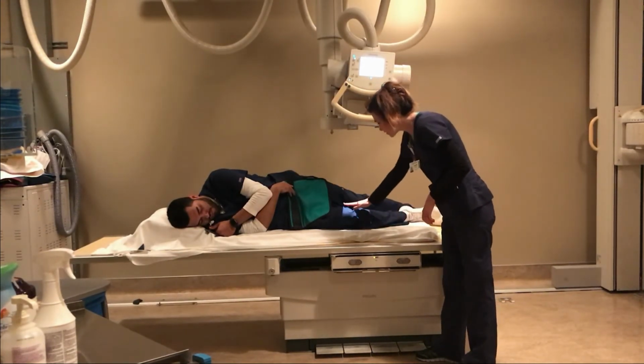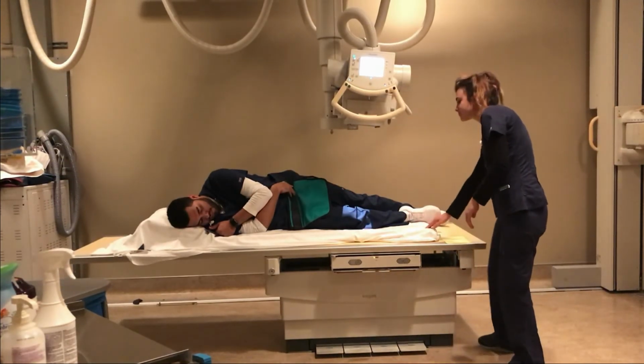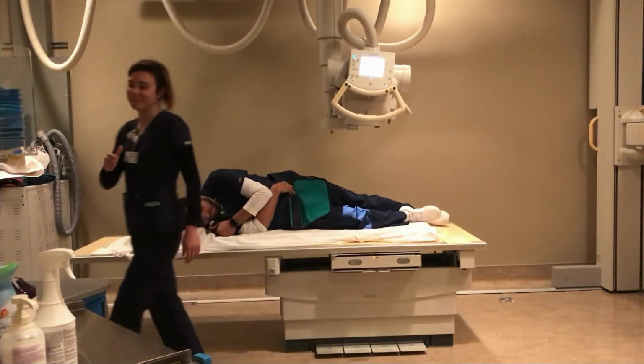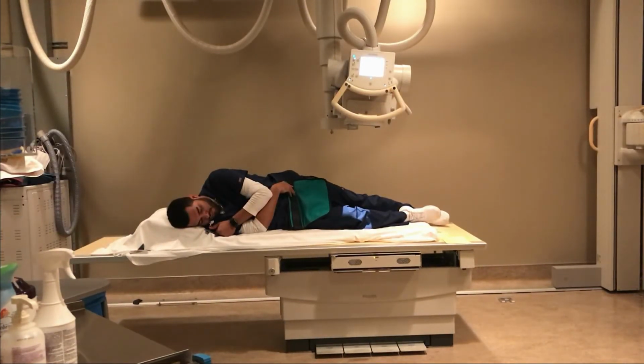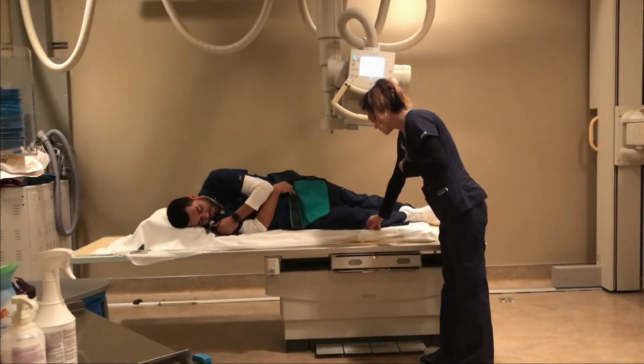Sure that it's in true lateral position. Alrighty. You guys having fun? Phil, just go ahead and stay still. X-ray. Alright, perfect.